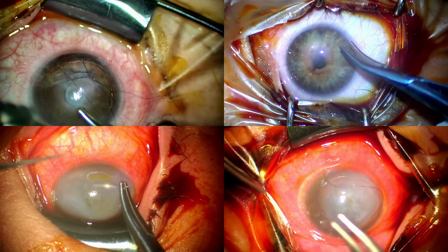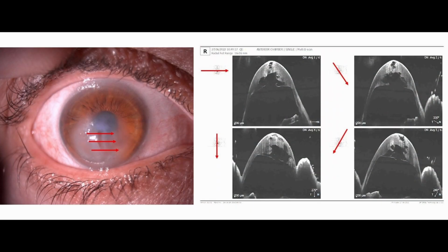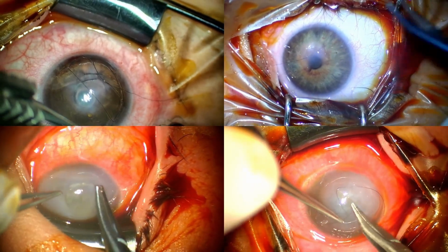We believe that surgical management is mandatory to quickly heal the cornea, reduce the symptoms, and improve visual acuity. Deep corneal suturing is the most important step. The orientation of these sutures must be perpendicular to the main axis of the Descemet break, which is difficult to assess behind the huge corneal edema often present.